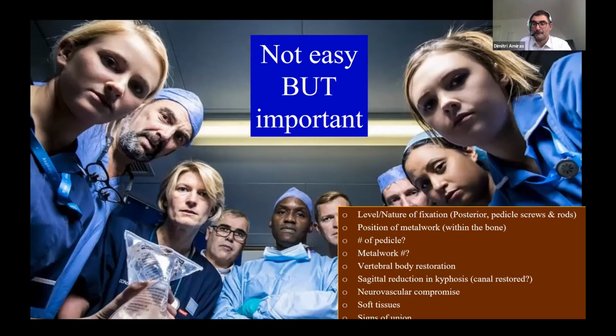Yes. Well, there it's actually a conversation between you and, in this case, the anaesthetist, because your chief worry there is, are there going to be any cardiopulmonary problems as a result of this? There are some CT-based studies that have shown that the incidence of cement leakage is exceedingly common, especially with vertebroplasty techniques rather than kyphoplasty. The reason is that cement has a variable working time, and people sometimes put the cement in when it's too wet. When it is, its viscosity is rather different, and so it can shoot into areas of least resistance, in this case being vessels.